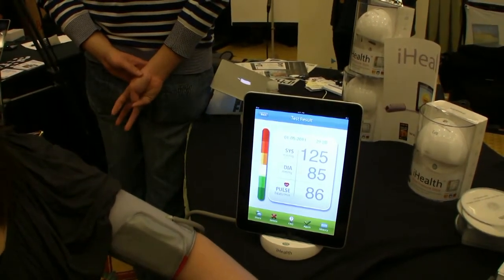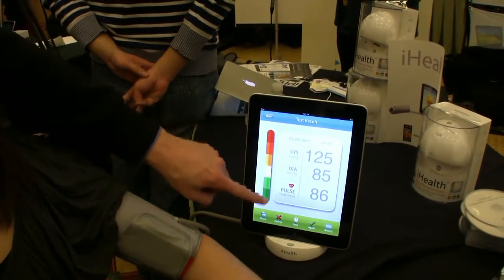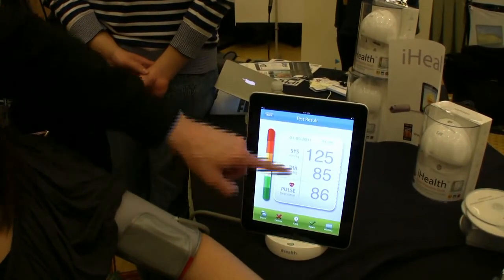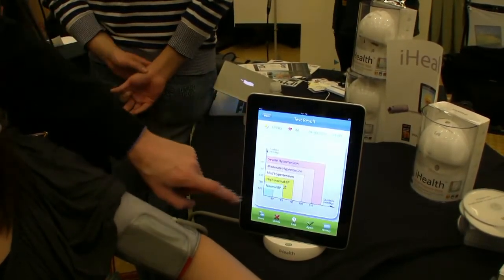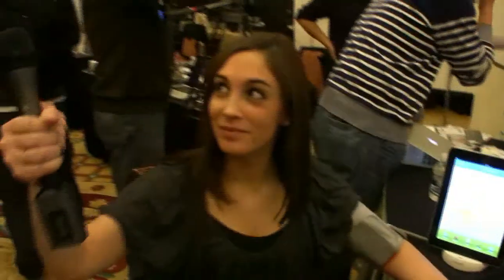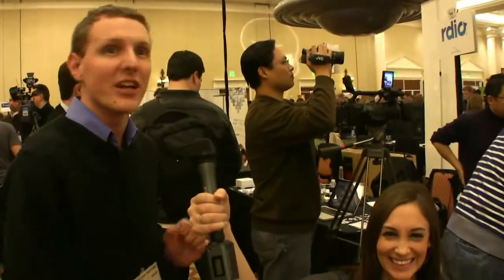Right there we see that CES has gotten to her, but it's actually not that bad. It's flashing yellow and if we scroll up, she's just on the borderline of high normal. So she's pretty normal, and given that it's CES and she's going through all this stress right now, that's pretty good.